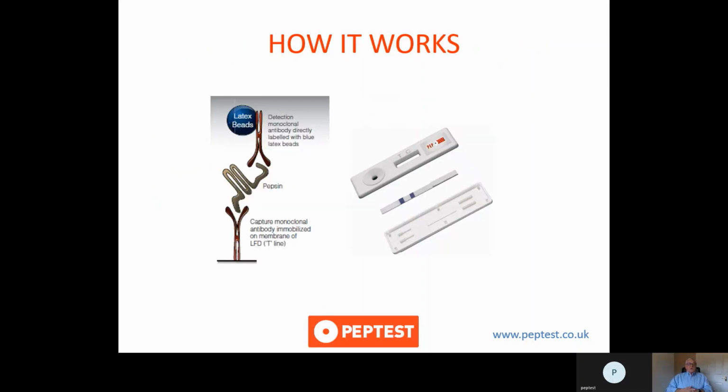So this is how it works, really. The two antibodies: one is to detect the pepsin in the clinical sample, and the second antibody is to capture it at the site of the test line within the lateral flow device. So the antibody is positioned just below the well here. It's then carried through by a migration buffer to the T line, and if there's pepsin present, it's then captured at the T line and will light up blue.